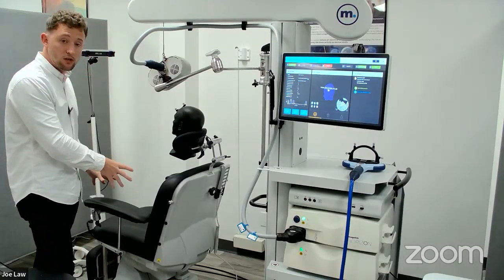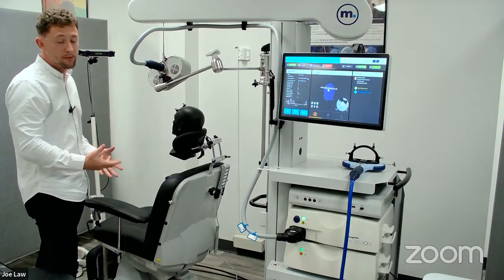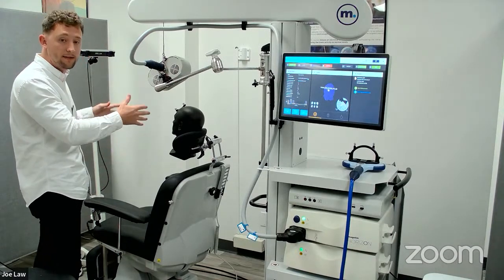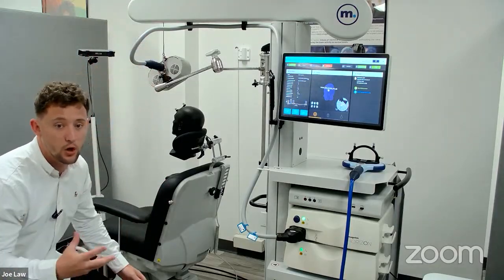The chair is also adjustable. If you've got a patient you need to bring up higher or take them lower, the chair is fully motorized. You can bring the height of the chair up and down as well. So there's multiple things here you can do to accommodate those people.